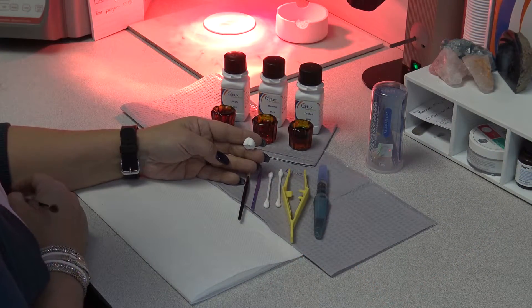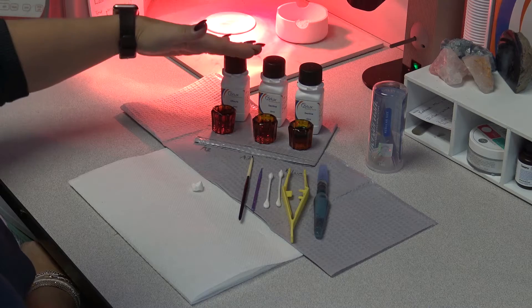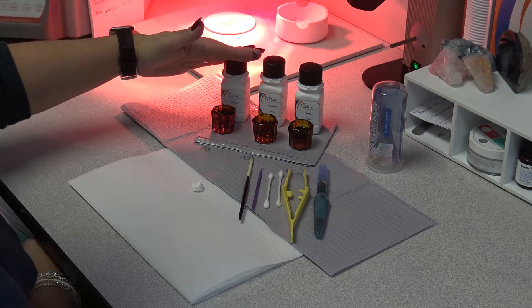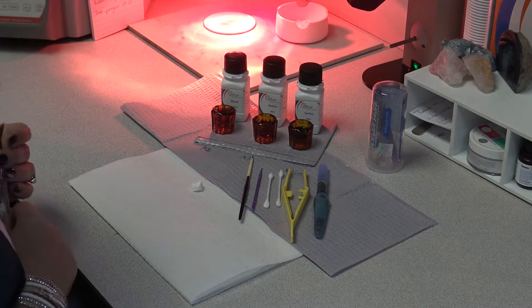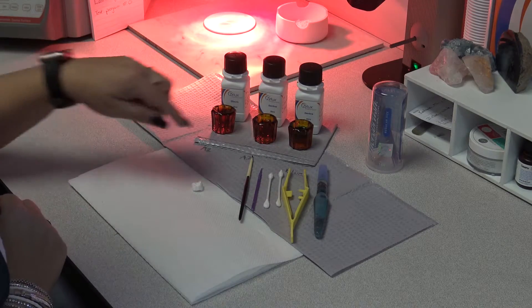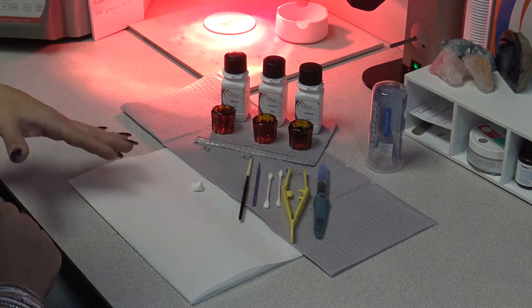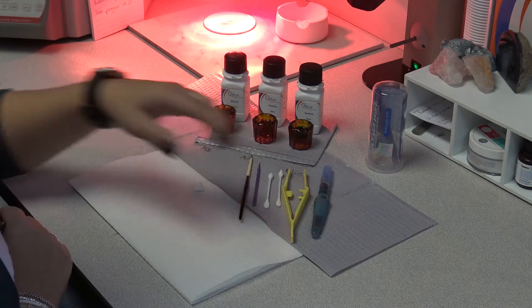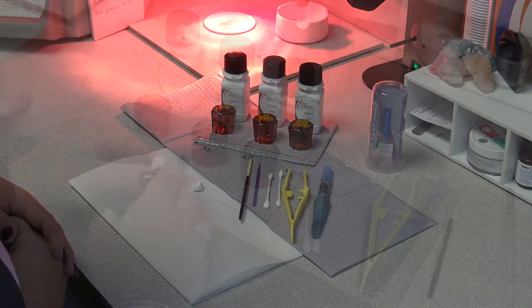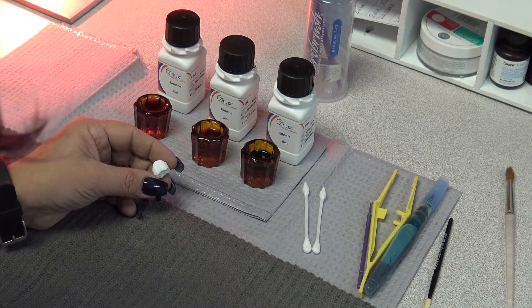Today we're going to shade a Zirlux 16 white zirconia crown using the Zirlux shading liquids — specifically the dentin and the effect shade blue. Some of the tools you're going to need are a small brush, or a micro brush if you like, some Q-tips for blotting the crown dry, and plastic tweezers — always plastic tweezers, never metal. We also have an aqua brush as another option. After you have post-processed your crown and thoroughly cleaned all of the dust off, you can start your shading process.